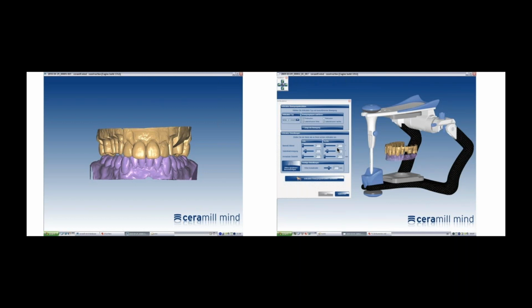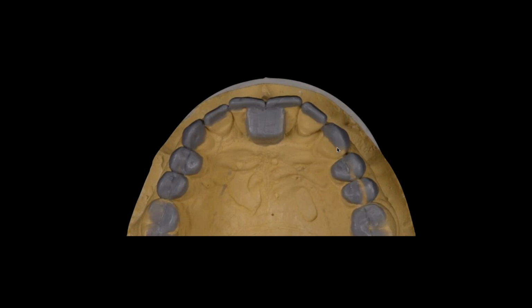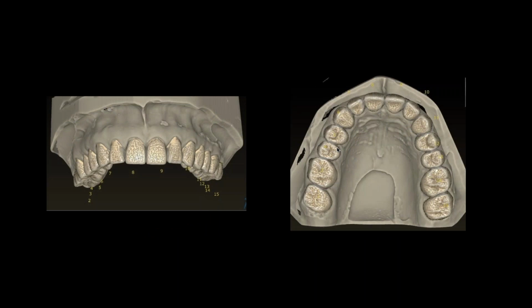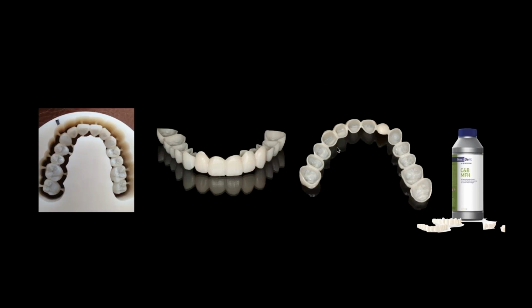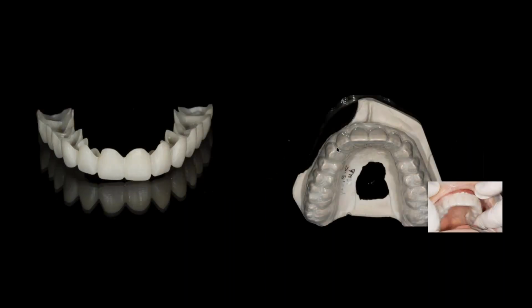I can actually utilize that horizontal reference either with an Artex or really almost any instrument at this point, because all I'm really referencing is the horizontal position. Sometimes we'll actually deprogram these patients, right, with our wax ups, but that's not something we need to go into today. And now that I have it in a digital format, I can also design it as a provisional restoration. If I want to make a provisional shell, I have many options here. I can actually mill it, I can print it, or I can inject it by hand. So I have 3 different versions of how I want to go and get this done.